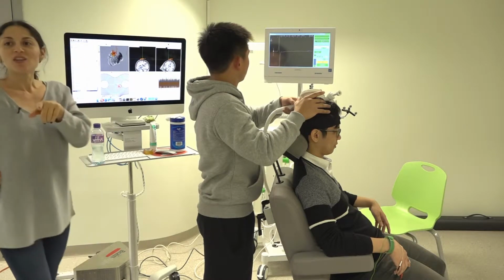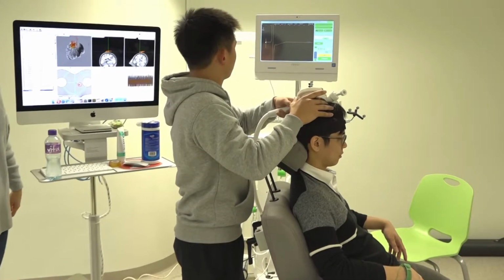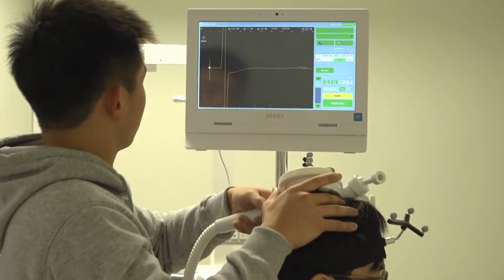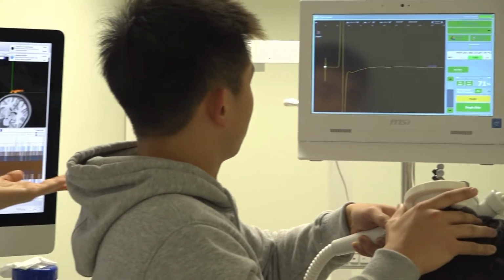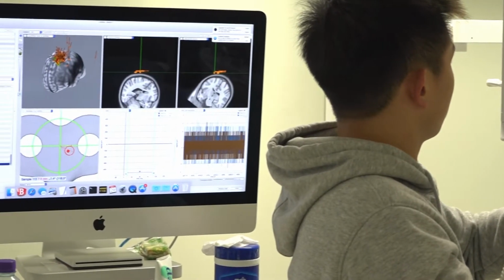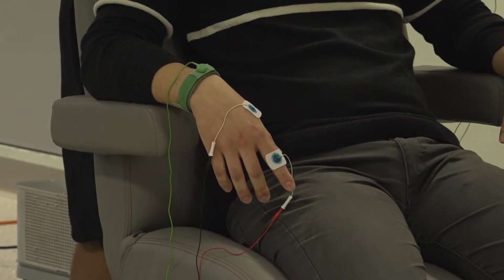Very good. But notice something. What is his spot? It's completely different to our spot. It's closer to my spot. You see, the variability is horrible, TMS. Don't use it. It's very variable, but he got a super good spot. Look, and I think better than mine, because his spot generates more. Stay there, that's very good. Great. Oh my goodness, this guy is a prodigy.